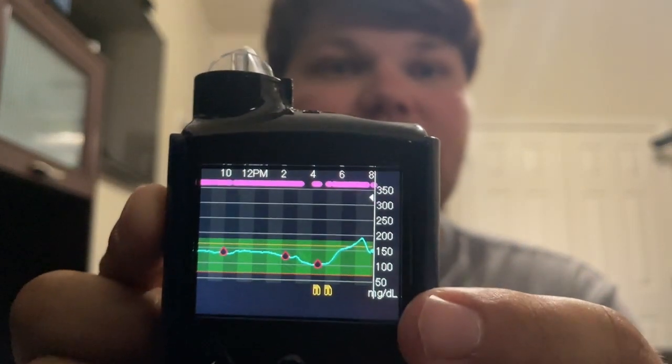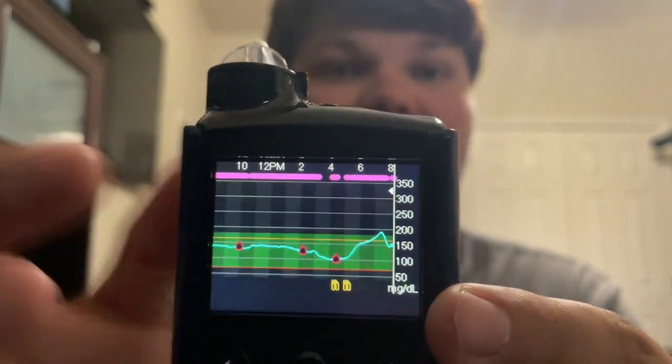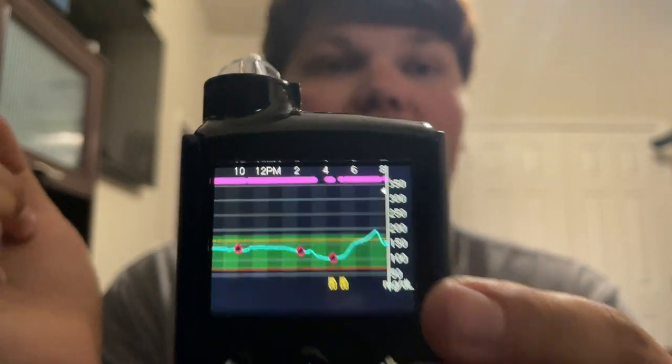So I'm going to kind of give you an idea. So this is a 12-hour look back on my graph. So as you can see on here, hopefully it focuses, those are very gradual and slow rises. And then you can see right here towards the end, I took 2 boluses for dinner. One bolus was for my main entree, and then the second bolus was for the little bit of dessert that I did have. And then as you can see, since I took that second bolus after I had eaten the dessert, I did rise up to about 190, and then I came right back down, and now my sugar is at 148, which is okay for this time of the evening for me, and I will be up for a little bit longer, so I should be good and stay within range.